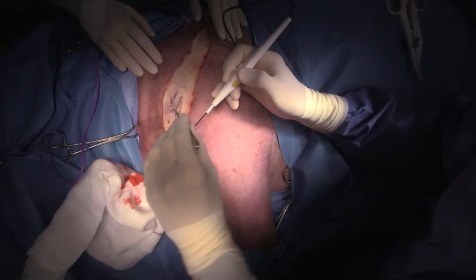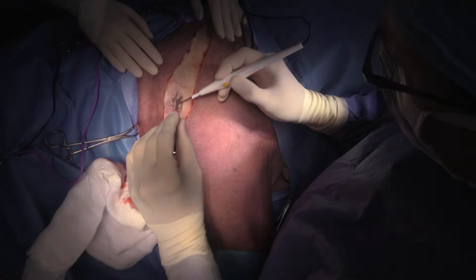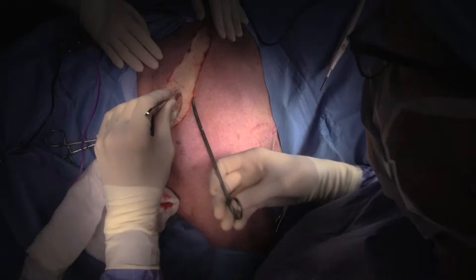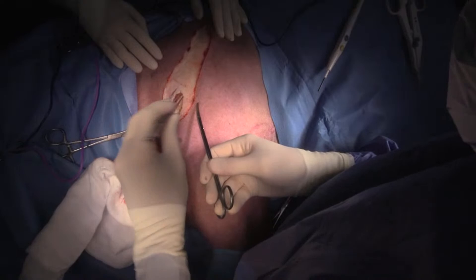So that's omotransversarius and serratus there, and then we'll get up into trapezius up higher. This is a Rhodesian Ridgeback, a large dog — it's about 45 kilos.